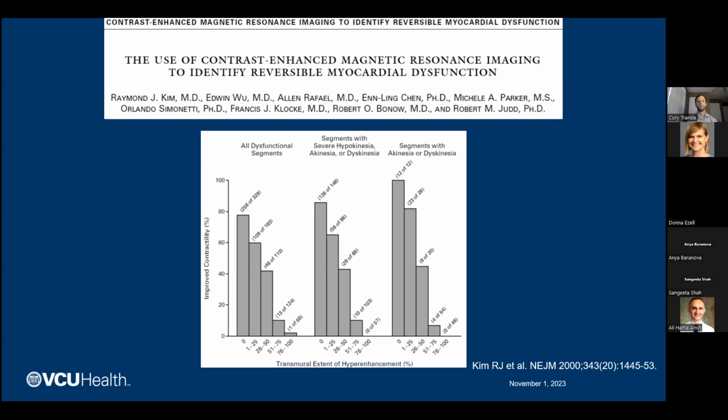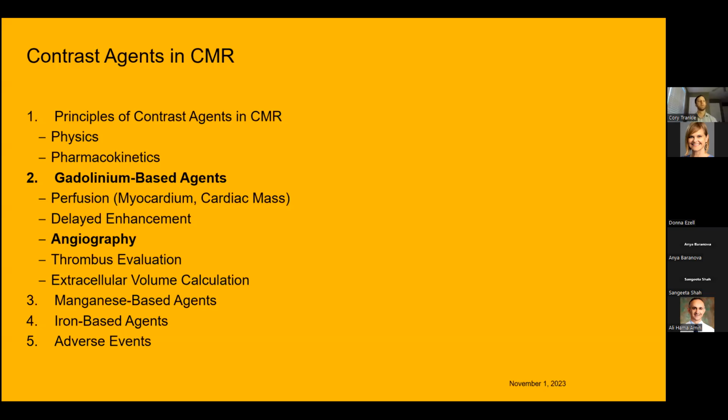Now, I know that this has been thrown into question a little bit with the revived BCIS trial. We should certainly visit that trial and what its implications are for how we think about viability in the MRI lab. But much of the data using CMR, because there's other ways of looking at viability, seems pretty promising that, if you don't have scar, you're more likely to recover some function in that segment if you revascularize it. If it's just complete transmural infarct, don't even bother. What's the point of revascularizing just a scar at that point?